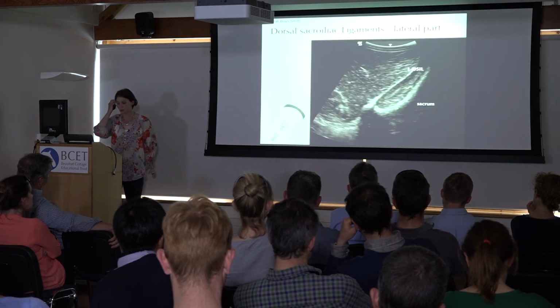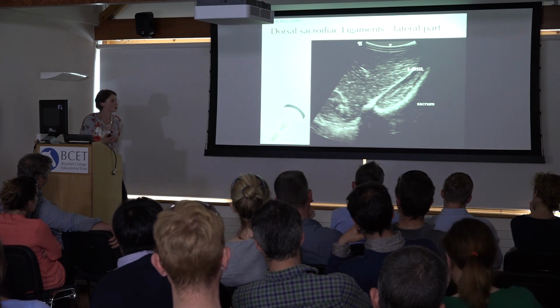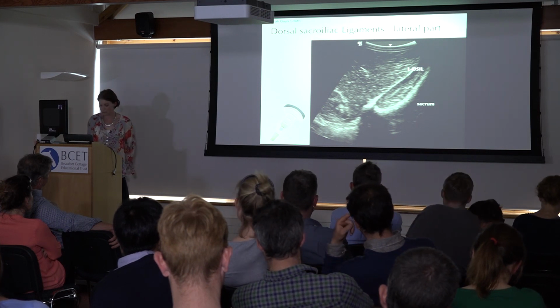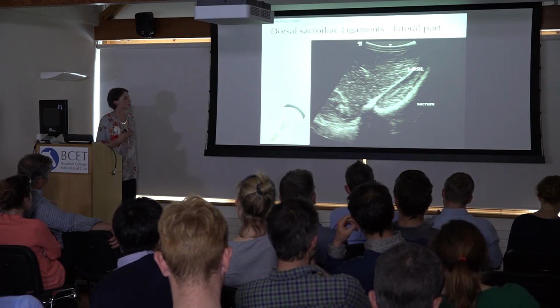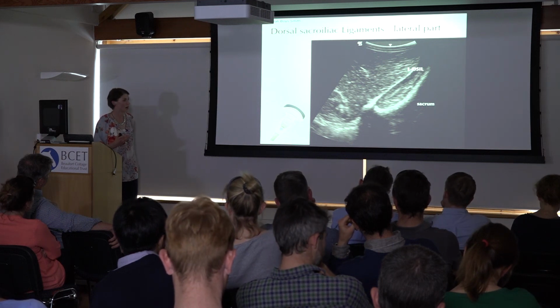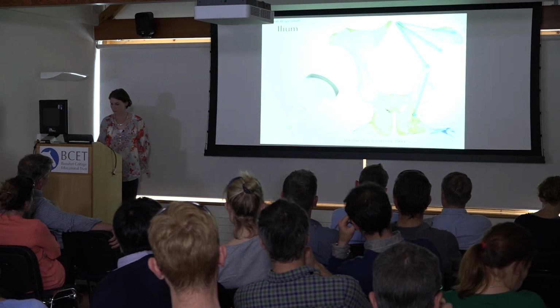As I said, the lateral part of the dorsal sacroiliac ligament we can image with our curvilinear probe. I've never seen a clinical condition of this part of the ligament at all. It's not something that's written up about, so it's a very rare cause of problems. But in general, I think the dorsal sacroiliac ligaments are useful to be able to scan. I think the clinical relevance of abnormalities in those areas is probably not particularly high, but it's important to establish that as part of your clinical exam, particularly for poor performance horses.